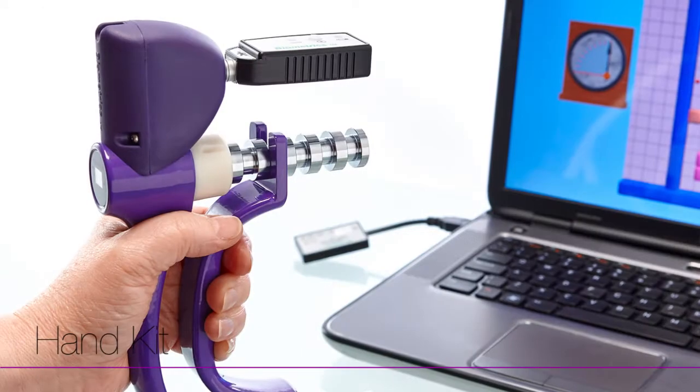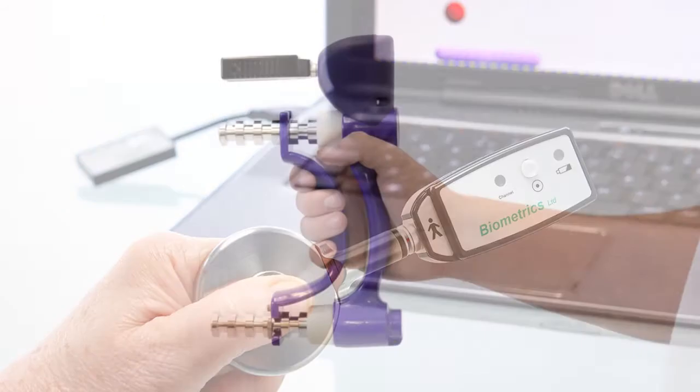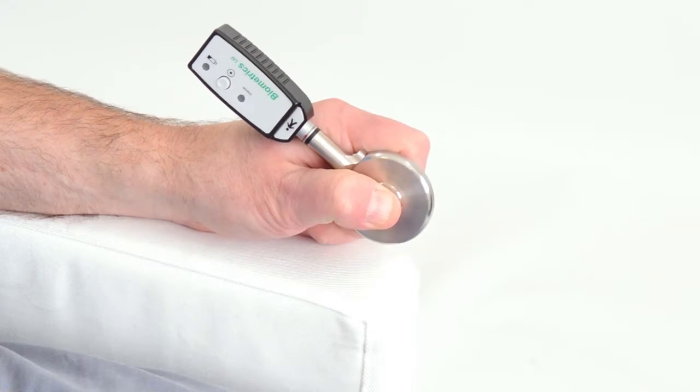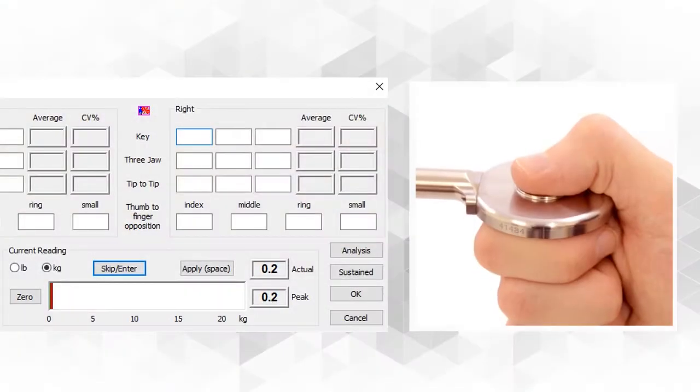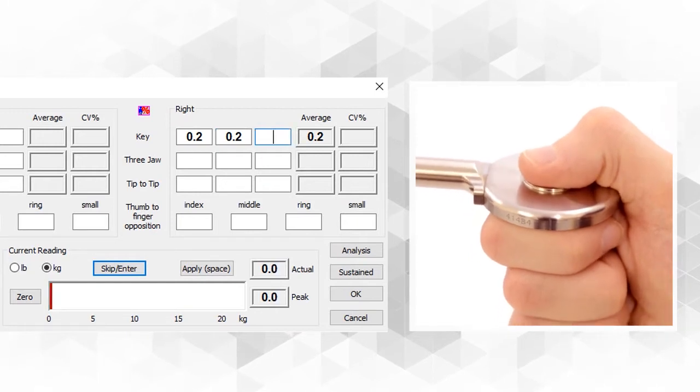The e-link hand kit includes a dynamometer and pinch meter, both precision devices that are designed not only for fast, accurate data collection, but with ample sensitivity to register as little as 0.1 kilos or 0.1 pounds strength measurements.